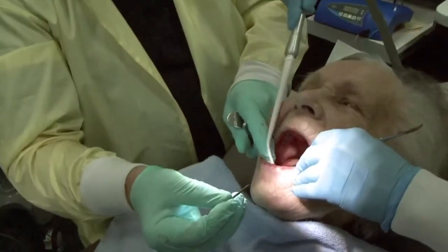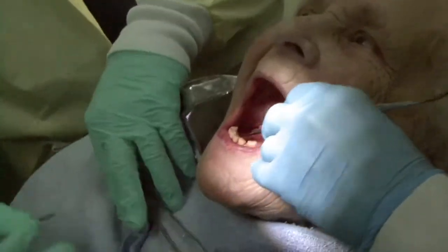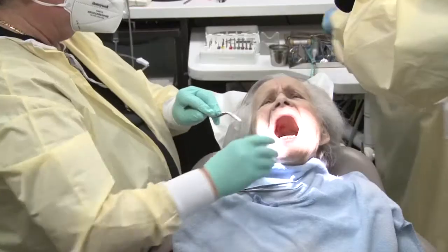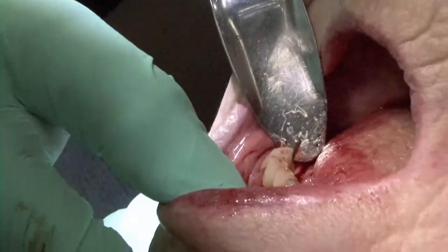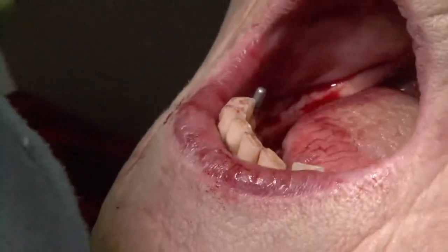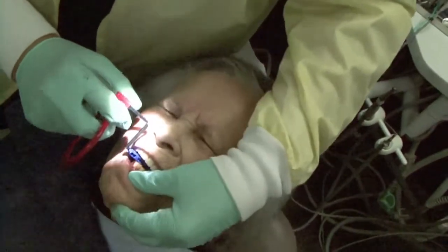So here's our alignment pin. We're going to place it into the surgical site so that we can take a radiograph. And it looks already like it's fairly parallel to our canine. Okay, Rosa, let's get ready for a radiograph. You can take a canine view if you like. Open just a little, open a little, close now.